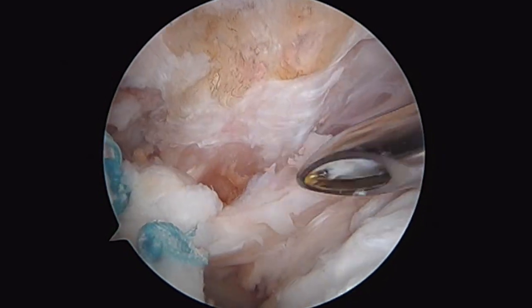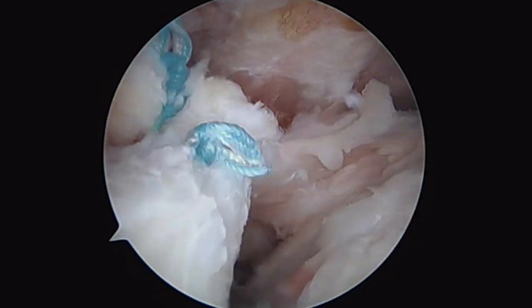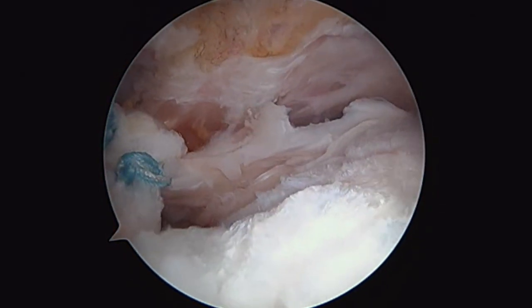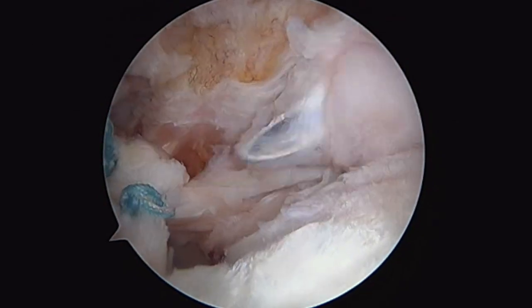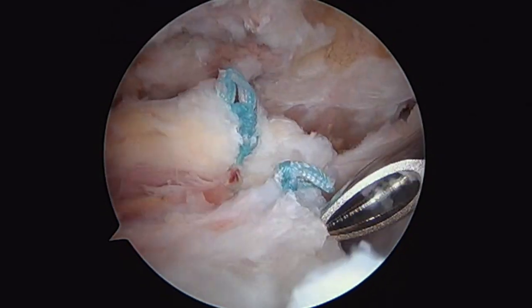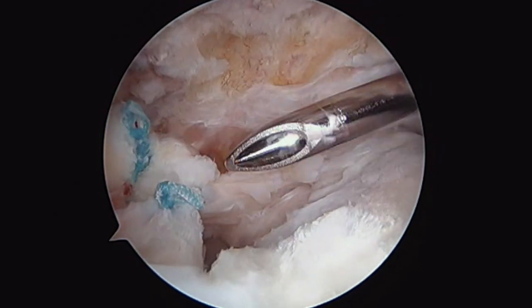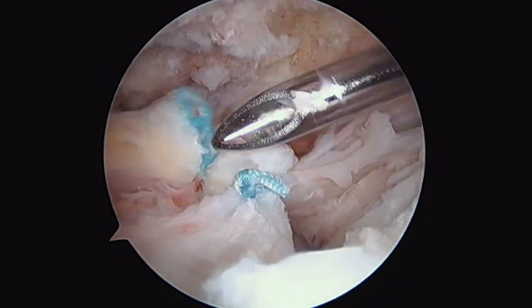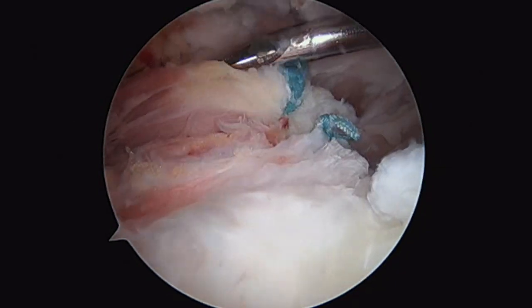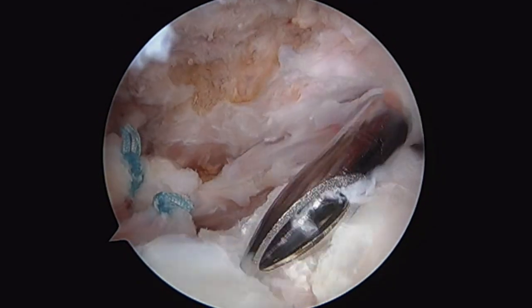You've got to release it if you want to get it back where it's supposed to be, because it's been back there for a long time. I've also established an anterior portal, which allows me to get back in with good angle and access some of this decent cuff tissue. Now we're going to get to work on part two. We're going to use some suture anchors and pass some horizontal mattress sutures from all the way at the back around to the front, and then bring them out and try to get this cuff back over here.